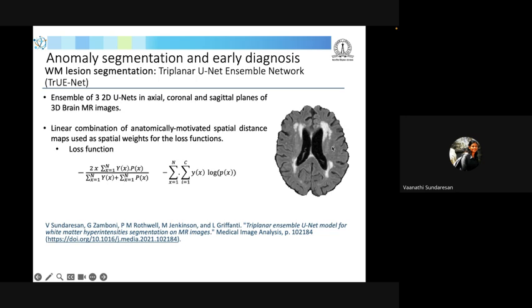But then you see these small regions here, the small lesions, which are virtually non-detectable. These are basically of vascular origin, found mainly in hypertensive subjects. They are the main factors associated with stroke. So identifying them at an early stage will help us identify the proper treatment plan for patients, and also be useful in proper drug administration and stopping the disease from progressing. So that is our first aim.